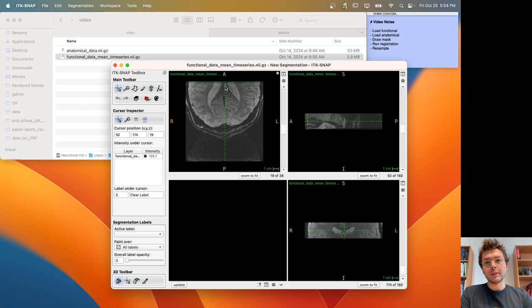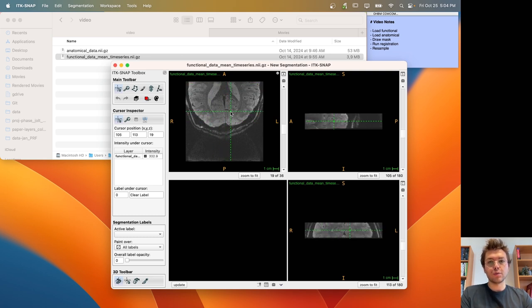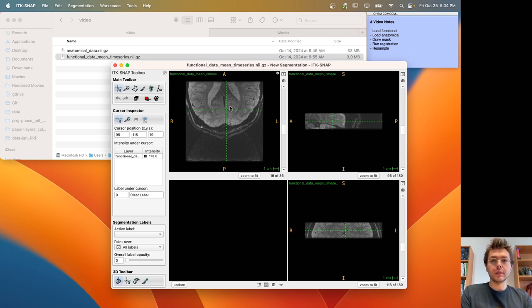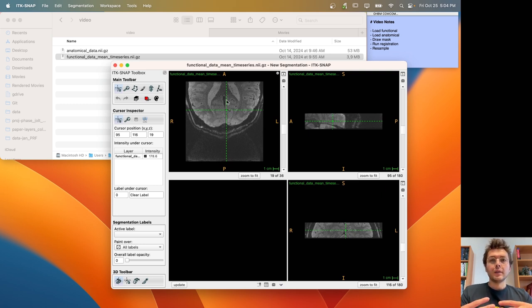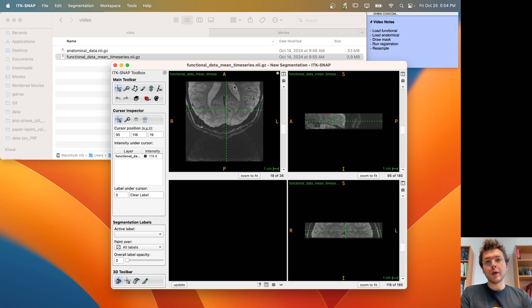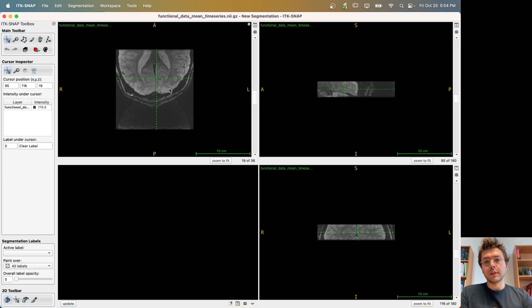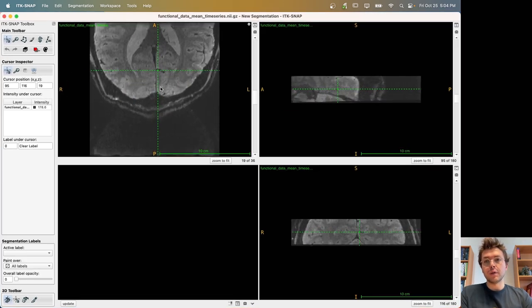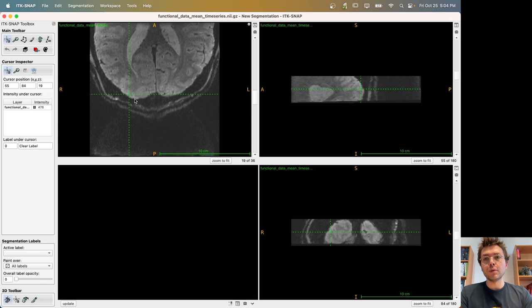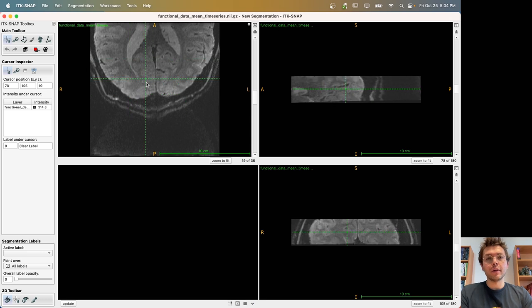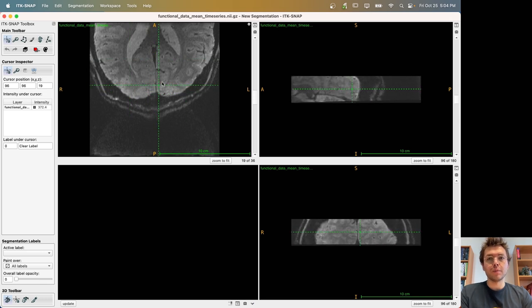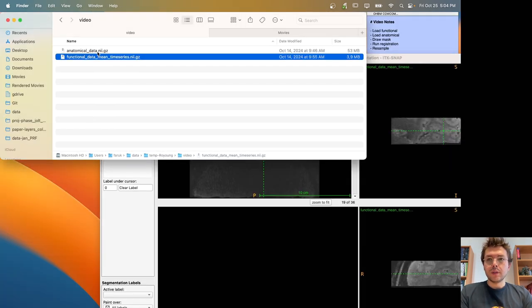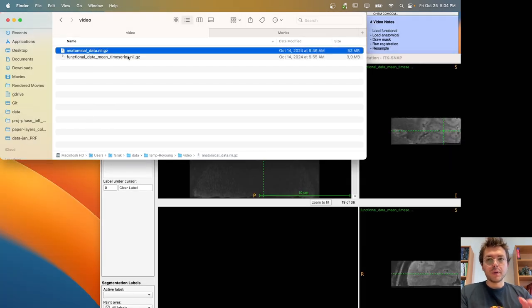You can see that this is a very challenging case to do brain registration because this is first high-resolution data, and second, it's partial brain coverage data, and third, the field of view is positioned in a way that the frontal parts of the brain is not visible. The regions of interest in this study, as far as I understand from Royang, and the way this slab is positioned is the visual areas of the human brain.